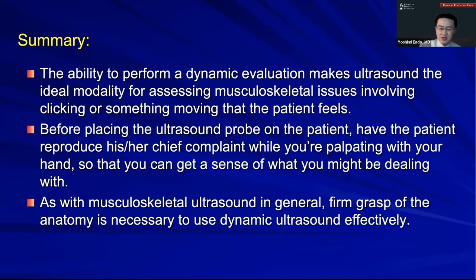Now again, musculoskeletal ultrasound in general is pretty challenging. It's different from MRI, because on MRI all the images are provided for you. If you're not familiar with a particular anatomy, a lot of it you could look up in a textbook, but you can't really do that when you're scanning somebody. You don't want to start opening up a textbook in front of the patient, so you really need to have a firm grasp of the anatomy, as in all musculoskeletal ultrasound, and particularly in dynamic ultrasound.